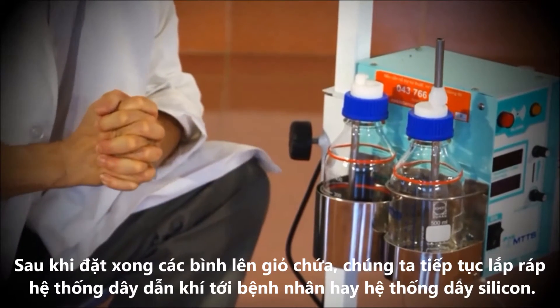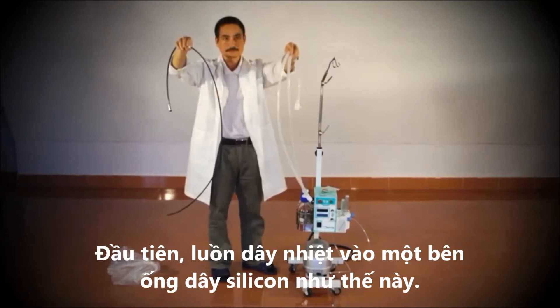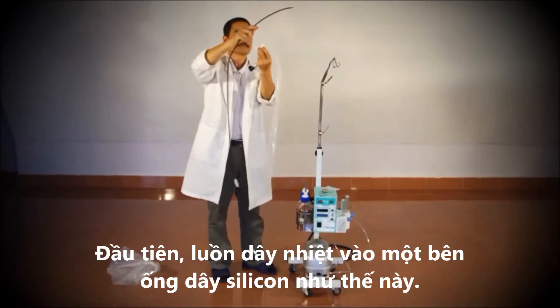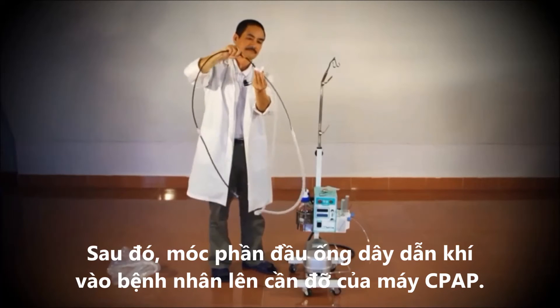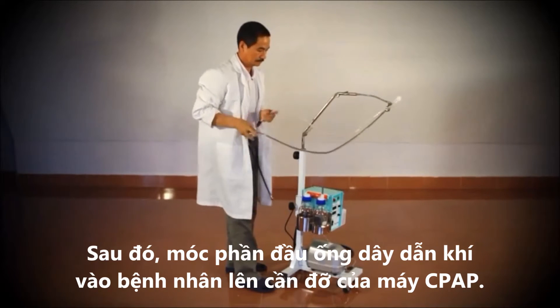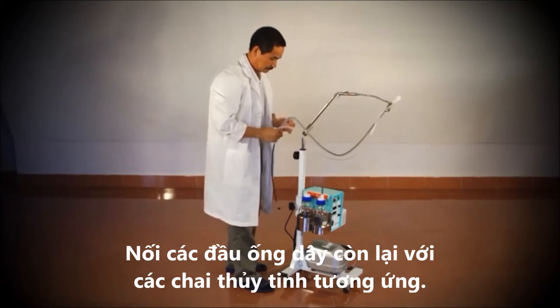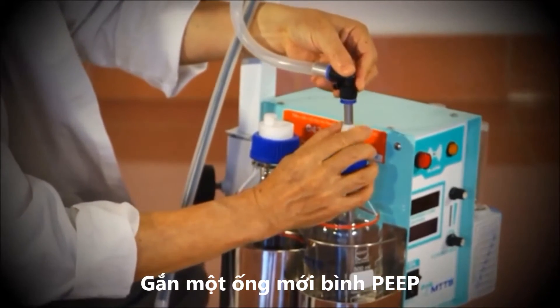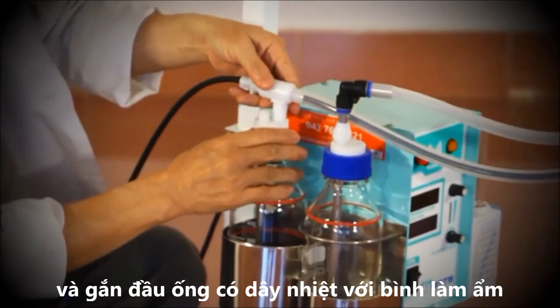Once the bottles are in place, we can connect the patient circuit or tube set. Attach the patient end of the patient circuit to the CPAP arm. Then connect each tube to its appropriate bottle. The tube is attached to the PEEP bottle. The tube with the heater wire is attached to the humidifier bottle.